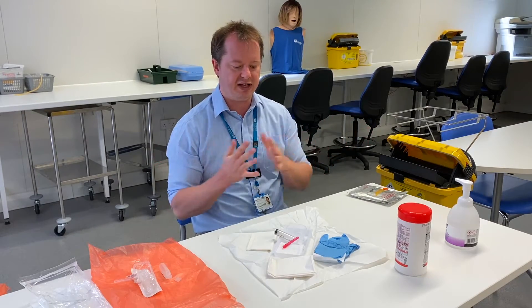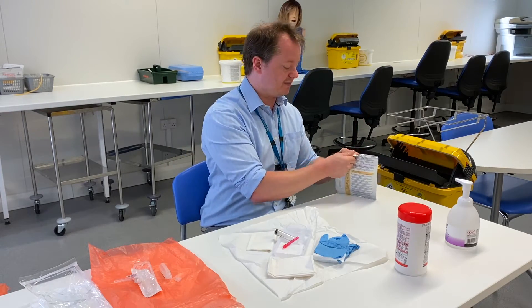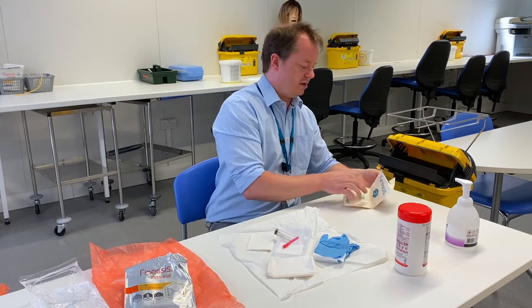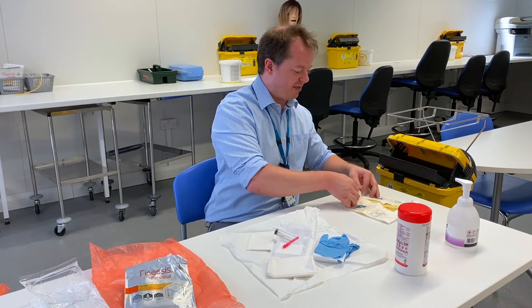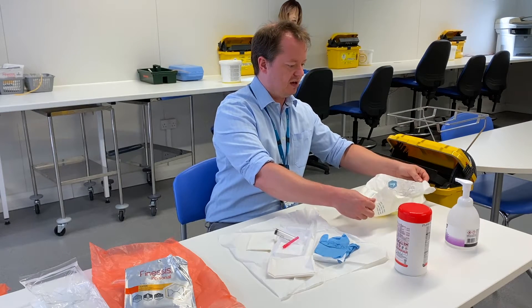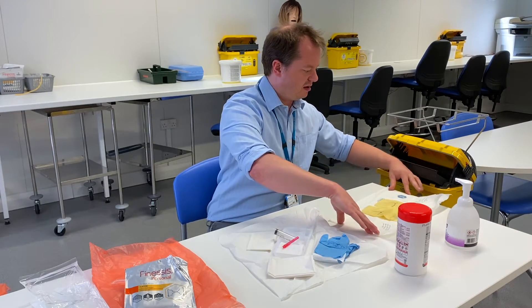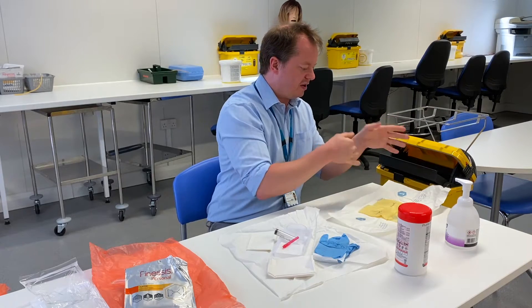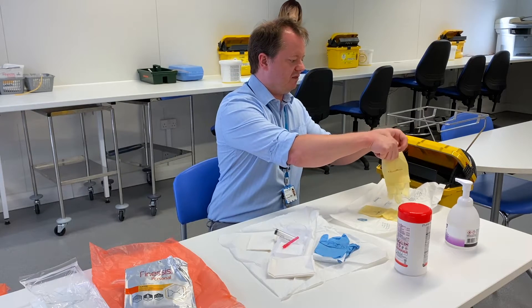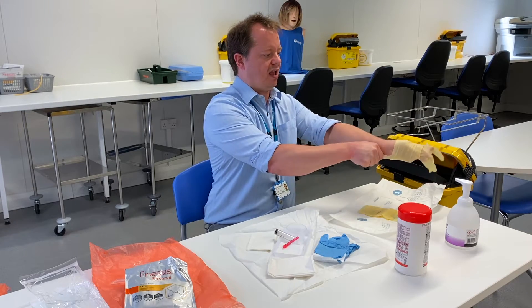When everything's ready and I've got all the stuff I need, I now need to start touching the sterile products, so I need to put on a pair of sterile gloves. I'm going to try and be as careful as I can when opening up the package, touching only really the very outside of the package, nothing beyond the creases, so I don't contaminate anything.